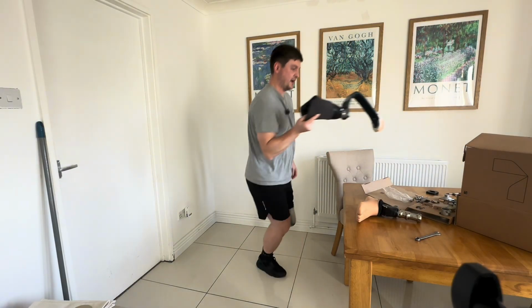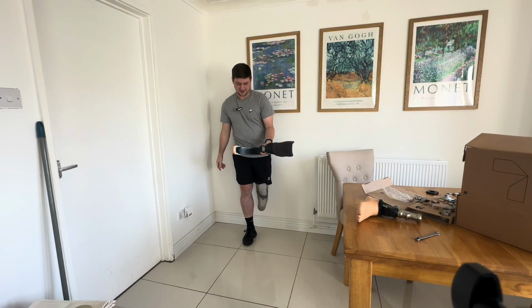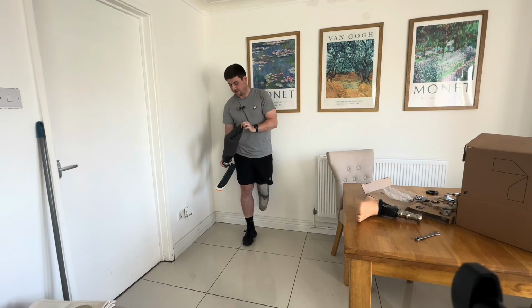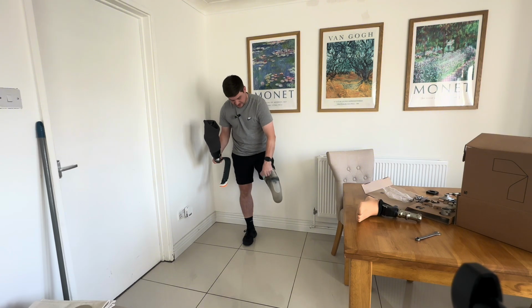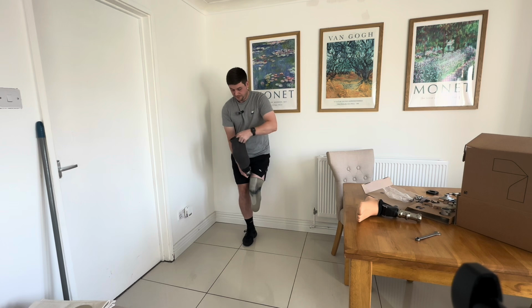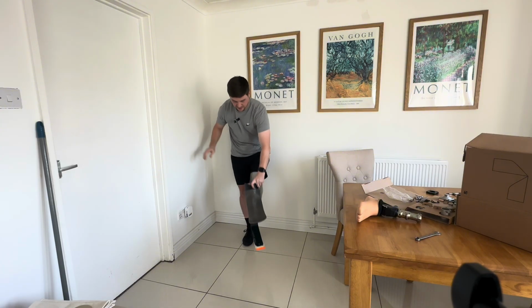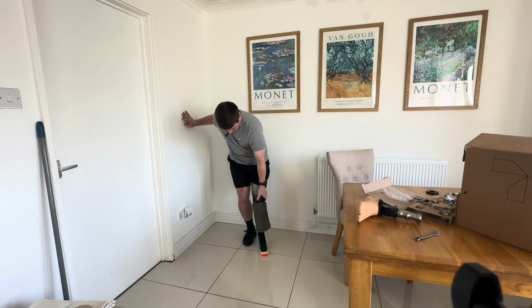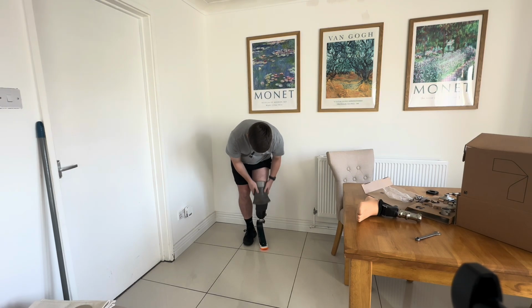This is going to be me trying the leg on for the first time because I thought it would be important to share, because obviously I'm going to vlog all this, but I've literally not tried this on yet. So basically how this attaches to my body is, this is a silicone sleeve that I wear over the top of my stump. This is a silicone sleeve that I wear on the top of my thigh. And basically that's like a pot inside. Oh. Put that in there. And just roll that over the top.